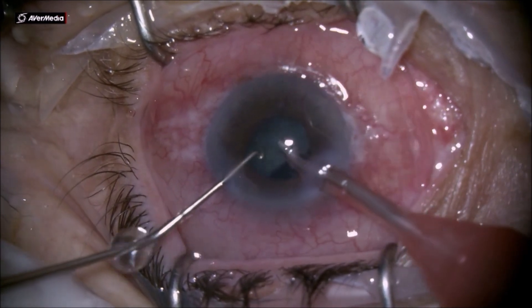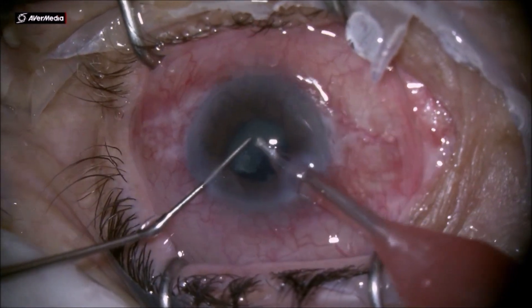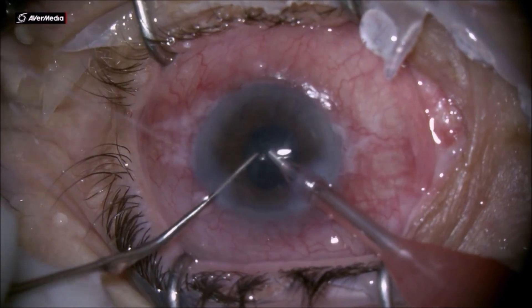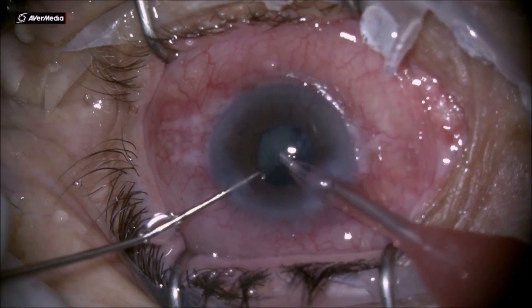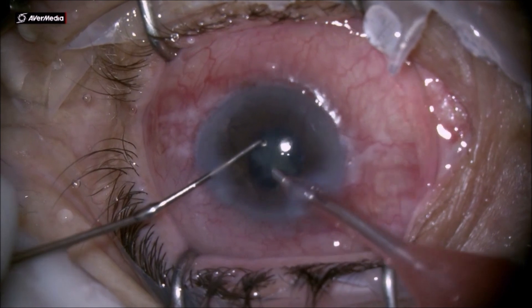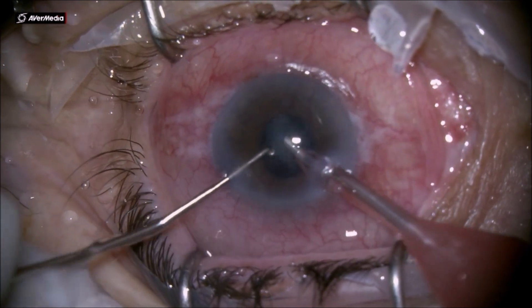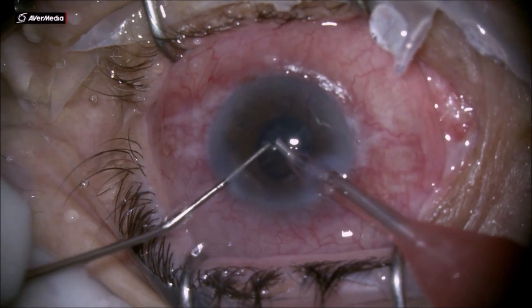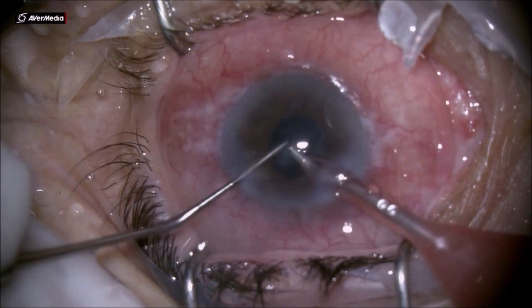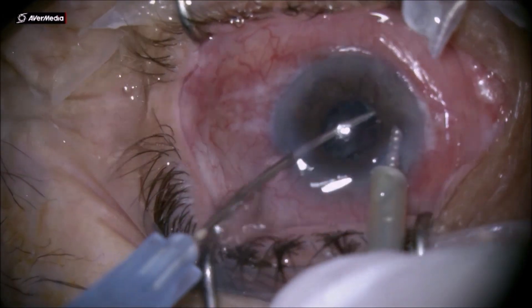You already have a very hazy cornea, so you need to use good viscoelastic and stay as far as possible from it. Because you have a small space, the posterior capsule is very flexible in these cases. You have to pay attention to take only small bits and pieces of the nucleus, and avoid a surge in the anterior chamber, because that can cause the phaco tip to aspirate the posterior capsule very easily in these cases.